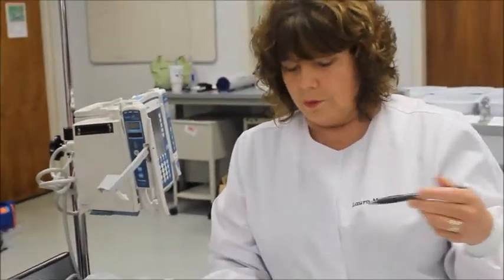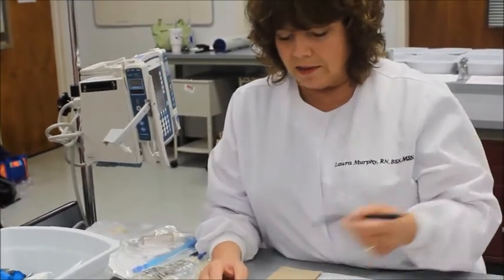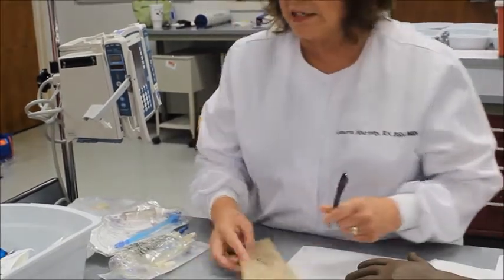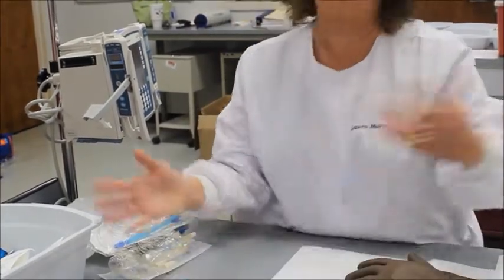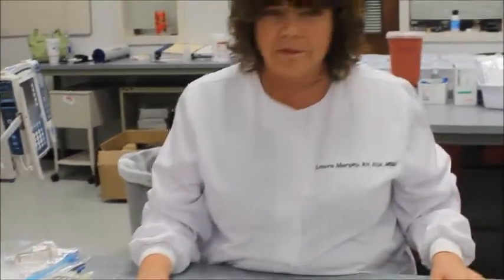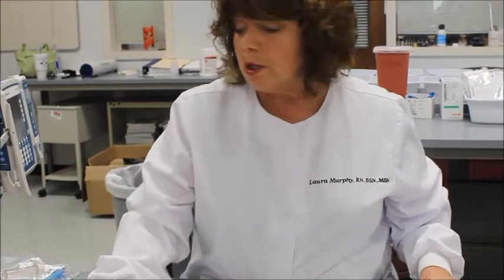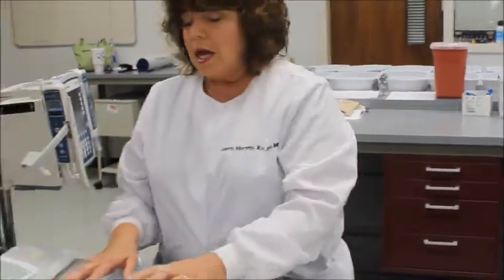Now, for those of you who reduce and everything, that's fine. Of course, I had to pick up the one with the strangest math. All right. So that's 3,086, 85. So we'll go with 85. You could round up in that case because that's a minimal thing, but 85 mLs per hour is going to be our minimum infusion time. Okay. So we've got that ready.